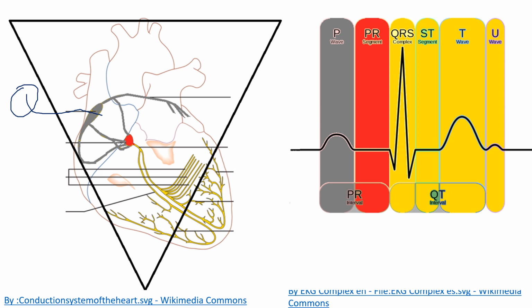And so then what that pacer is going to do is it's going to say, all right, 1, 2, 3, up, you didn't do a heartbeat, zap. 1, 2, 3, you didn't do a heartbeat, zap, right? And so it's going to have a built-in delay. And so if I do not sense that you're telling my heart to beat at a rate of 60 to 100 beats per minute, I say, you know what? Time to step in. Today is not a good day for this person to die. And so I'm going to start zapping that heart. And so it'll go zap, zap, zap, zap, and keep that heart rate normal.